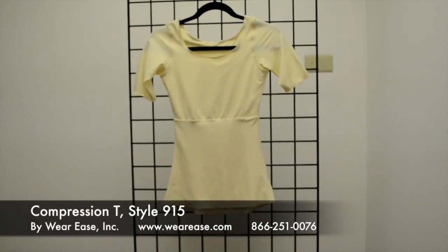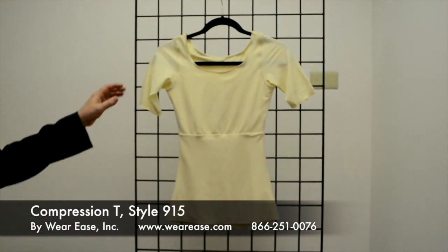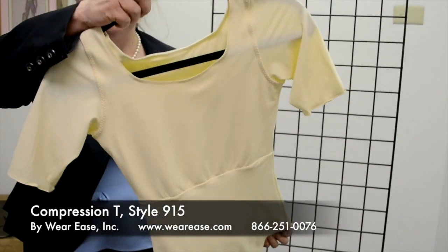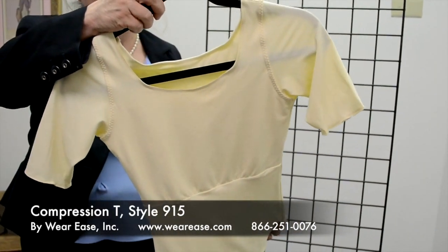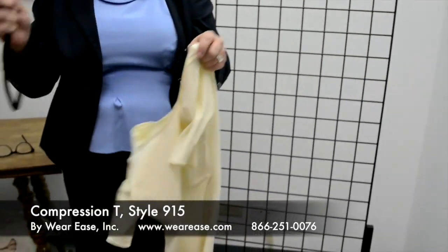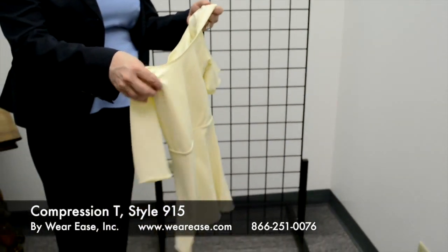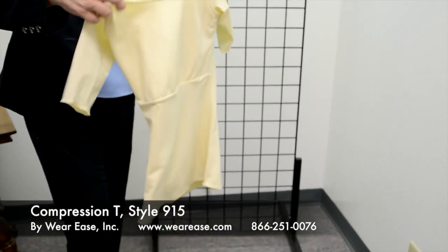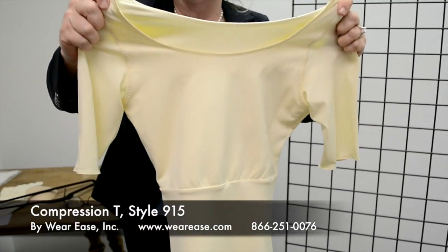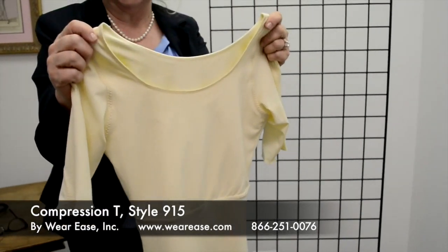Here we have the last item in our collection — our most recent creation. This is what we call the compression tee by Wear Ease. It is similar to our other camisoles in sizing and fabric, but based on feedback from our therapists and fitters, we've created a garment with a sleeve to provide more coverage between the woman's compression sleeve and compression top.